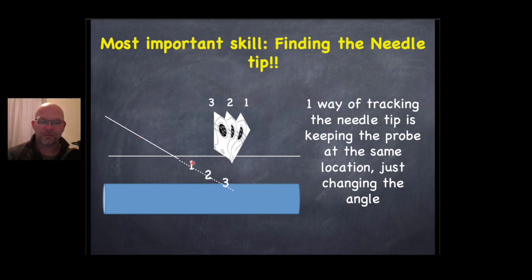Your needle tip could be way through the vessel, but on your screen, you see a metal reflecting dot in the center of the vessel. Well, that's true, but what you're seeing is that shaft right here in the middle, not the tip that's all the way through. So one way of doing this is to fan your transducer back to where you're catching that needle before it enters the vessel itself.